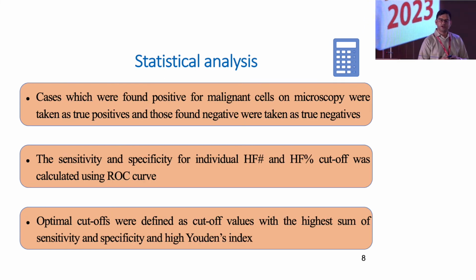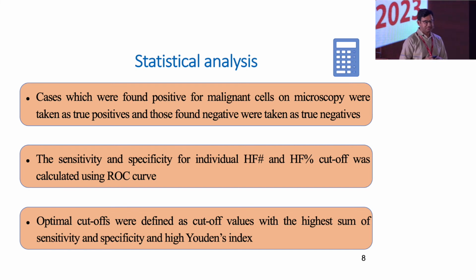Cases which were found to be positive for malignant cells on microscopy were taken to be true positives, and those which were found to be negative were taken as true negatives.